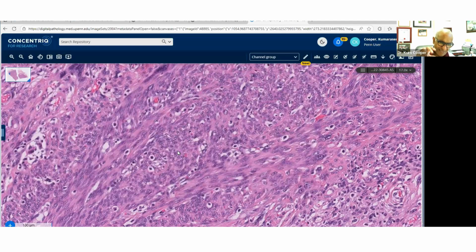So that really is probably the most important takeaway, WT1 and the ER, because when you're looking at pelvic smooth muscle tumors, groin, inguinal, in women, obviously I'm talking about female genital tract, then you need to establish, is this of Mullerian origin or is it of soft tissue origin? Because your criteria are different for both those, okay? In soft tissues, when we see one mitosis in smooth muscle tumors, we get really concerned.